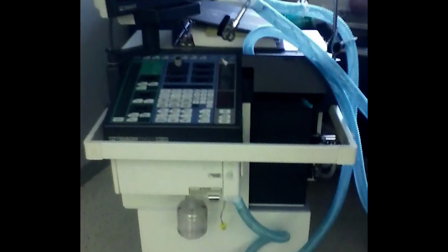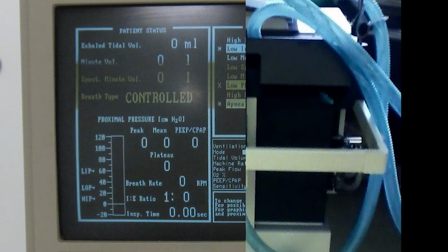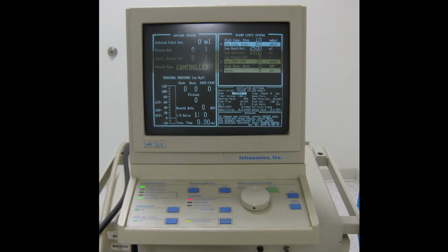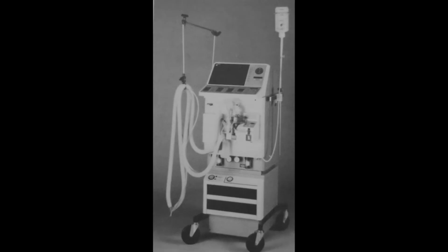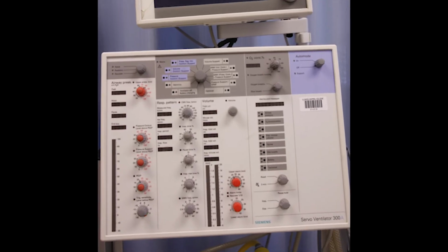The third generation of ventilators had a microprocessor control, the ability to flow trigger, had IMV, pressure support, as well as the ability to do pressure and volume control. SIMV could be done in volume and pressure control, with pressure support added to the IMV breaths. Some third generation ventilators had airway pressure release ventilation, or APRV, available.